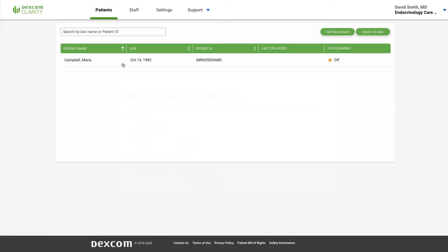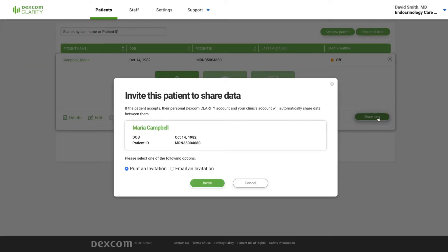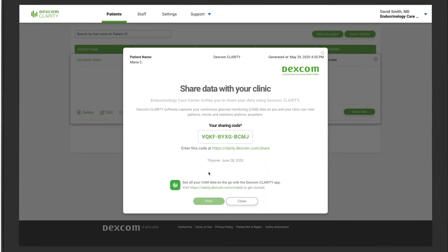For patients already added, click the patient's name, then click Share Data. Click Print an Invitation to view or print the share code, then click Invite.